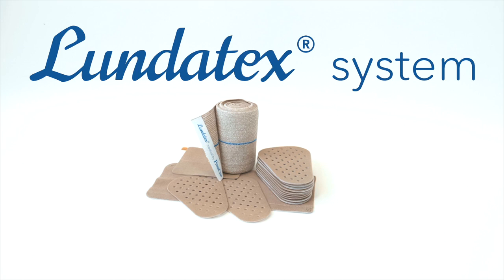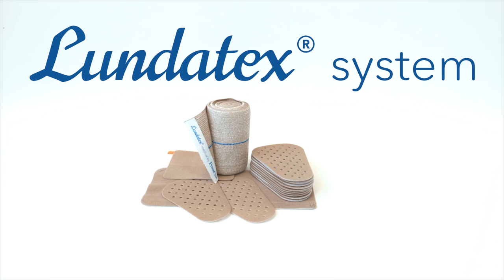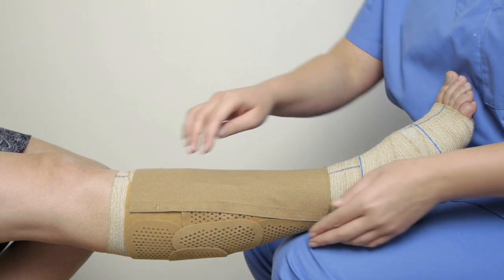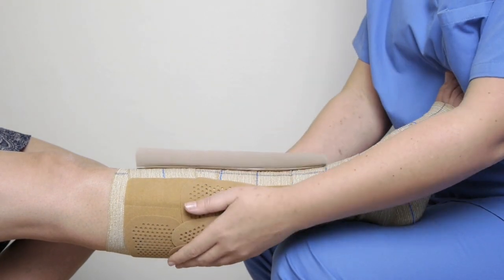Lundetec's system improves venous return during activity while maintaining a safe, comfortable resting pressure. The patches are used over Lundetec's medical bandage. The pressure can be maintained for 7 days with a daily adjustment of the fixed patch.